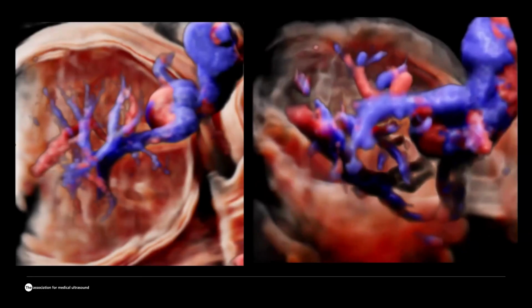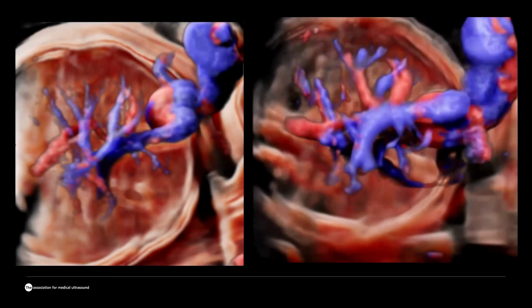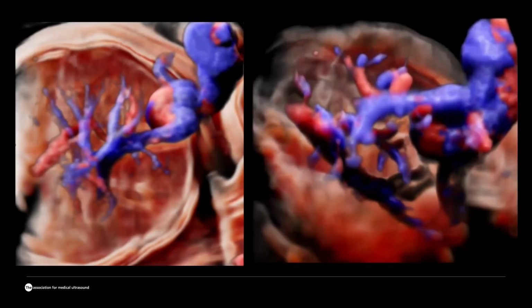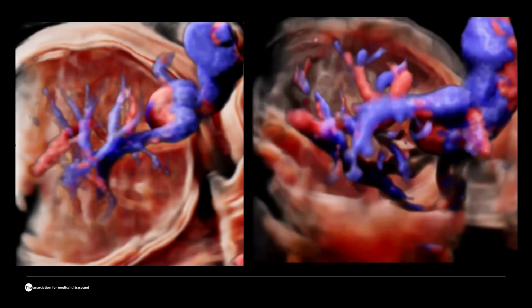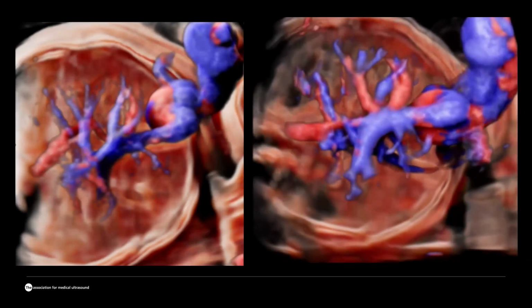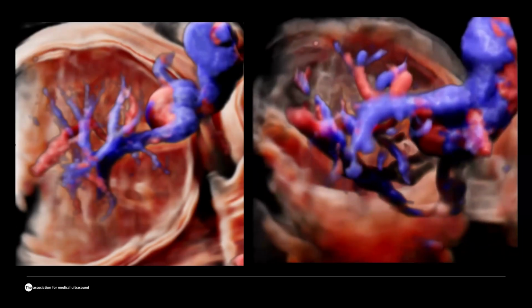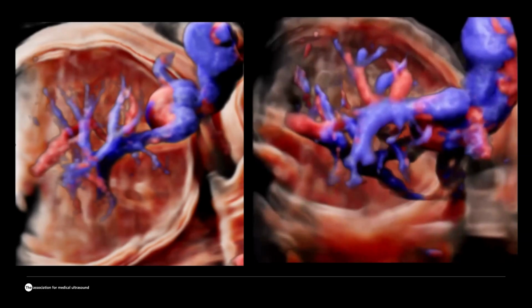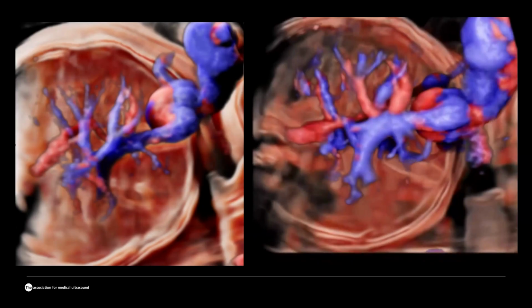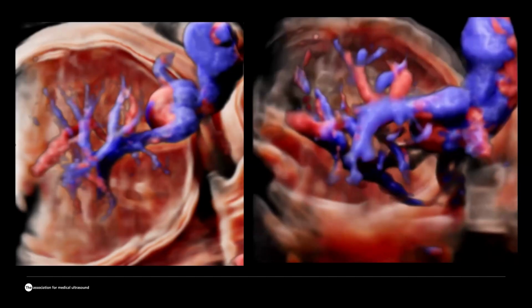And I would like to finish my presentation with this observation. I think that many of you are very skeptical about 3D imaging. And this is a patient whom I literally scanned yesterday, and her story was that she was a super stat. Her referral said stat, stat, stat, stat, ultrasound 5 times. The patient was told that the baby has a gigantic aneurysm of the descending aorta that may rupture at any time. So the patient was extremely upset, crying from the very beginning.